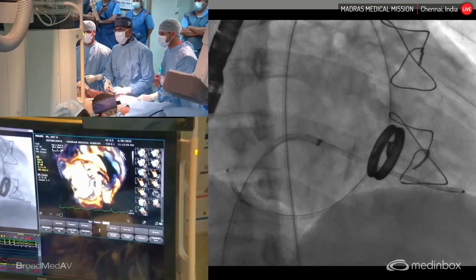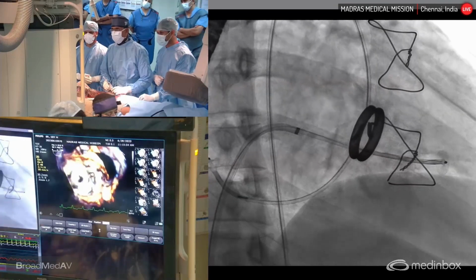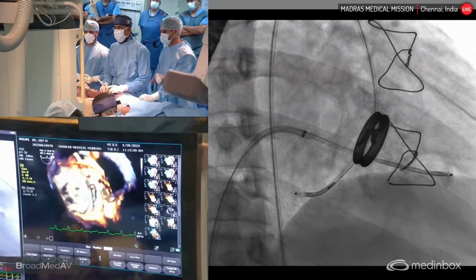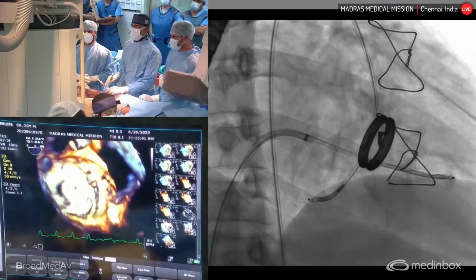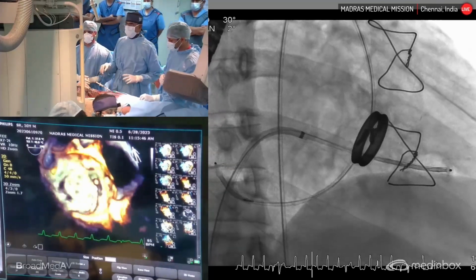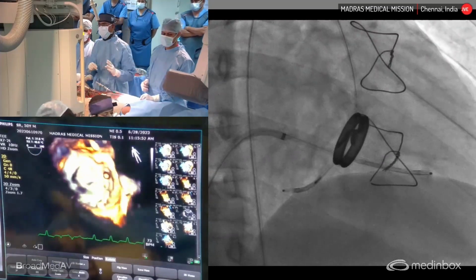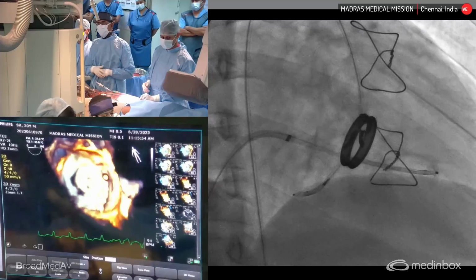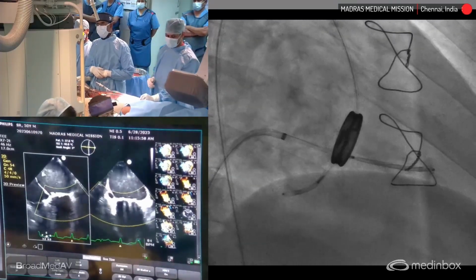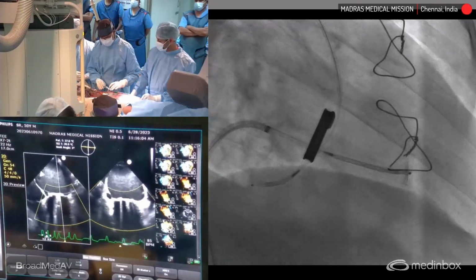I'm trying to get it up. So here, what I'm planning to do is get one of the plugs to come closer to the mitral valve. So now I have two plugs, one from this side and one from that side. Currently we'll target the larger plug. I want the disc to be made exactly profiled, so give a cranial or a caudal on this. Yeah, further, further, make it like a flat disc. Absolutely in profile. Perfect view.